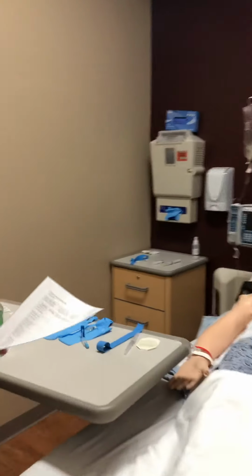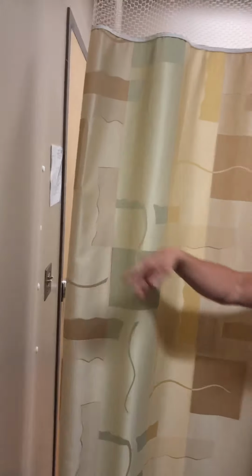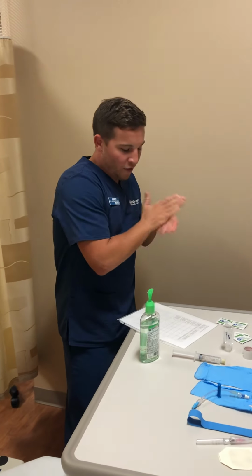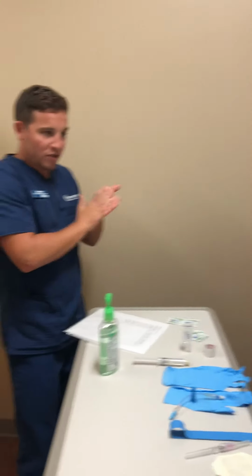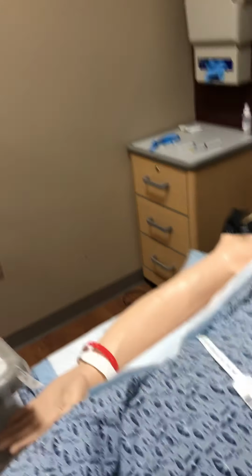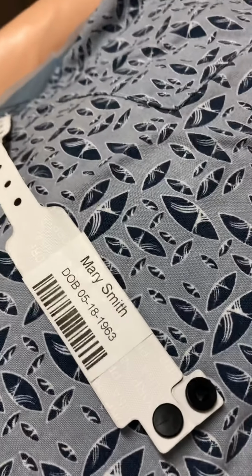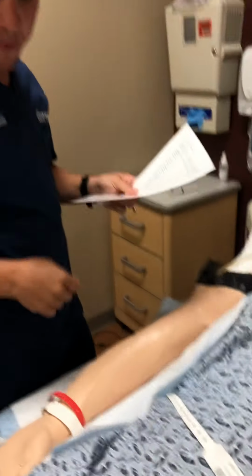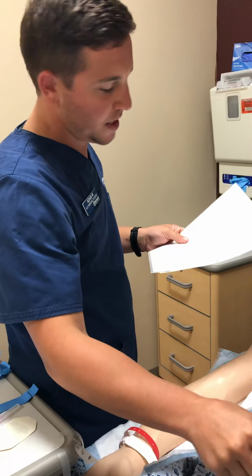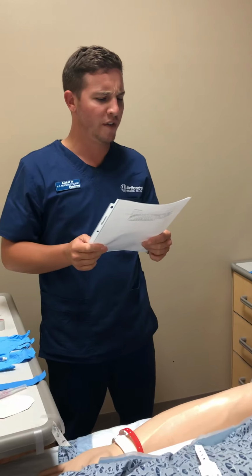Knock, knock. Good morning, Mary. My name is Adam. I'll be your student nurse today. I'm gonna shut our blind here, give us a little bit of privacy, okay? All right, wash my hands here. So first things first here, Mary, what is your full name and date of birth? She says Mary Smith, date of birth 5/18/1963. We look at her armband. Her armband checks out. Mary Smith, 5/18/1963.